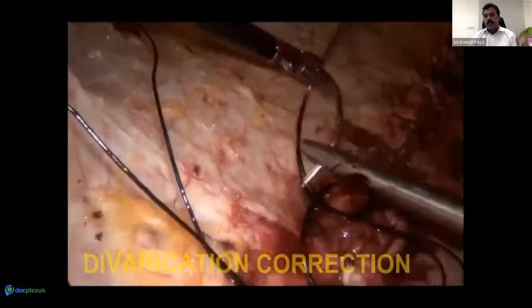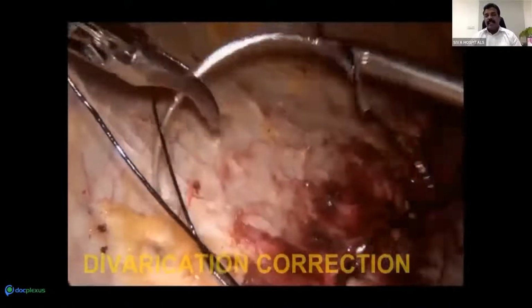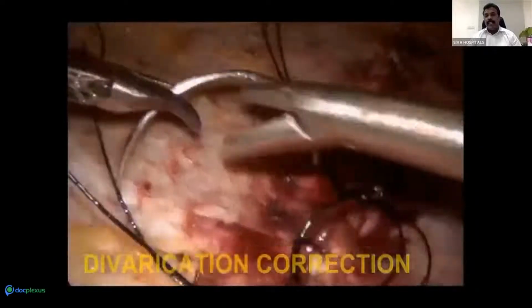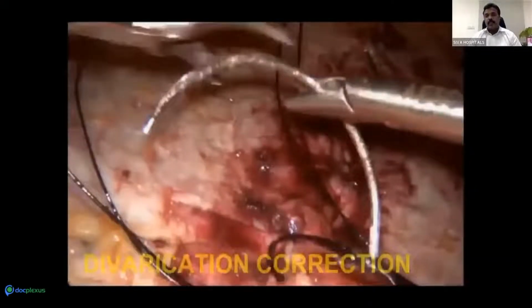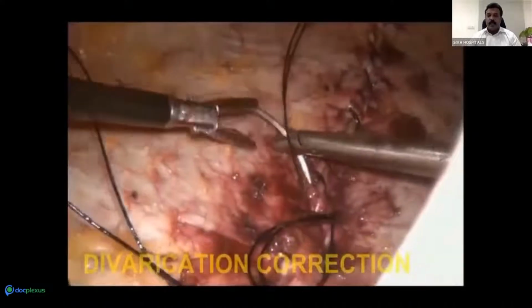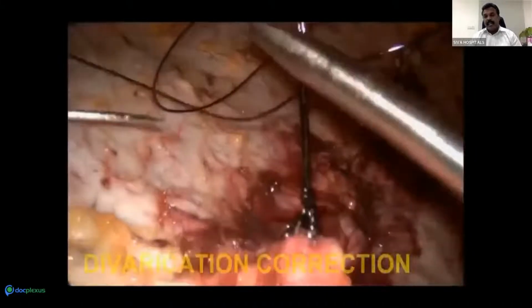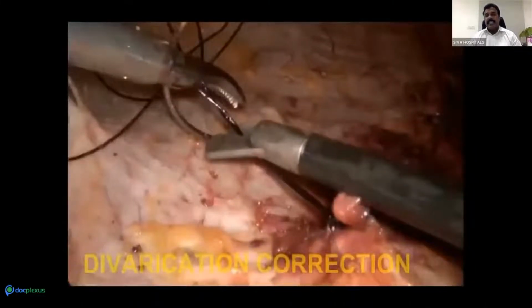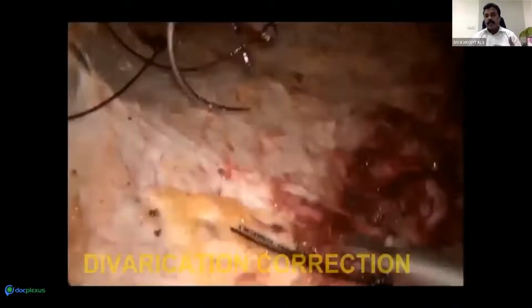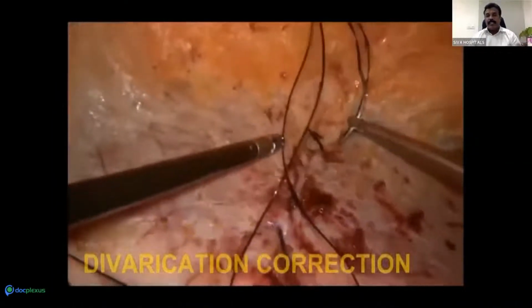The way the gynecologist does the looping knot, in the same way make a loop and rotate the needle inside around 6 to 7 times. Then your suturing hurdles will be over, because otherwise you have to open 2 to 3 centimeters and do the last part with hand suturing. If you want to do it completely with this one suturing, then this is the best way.